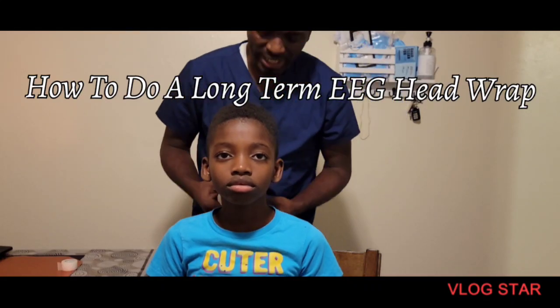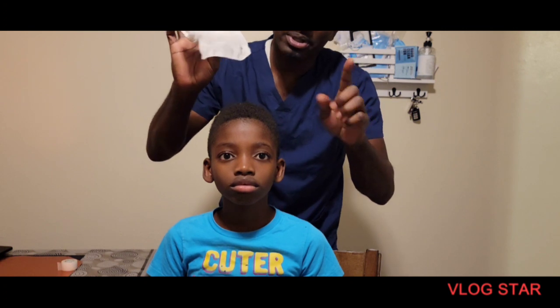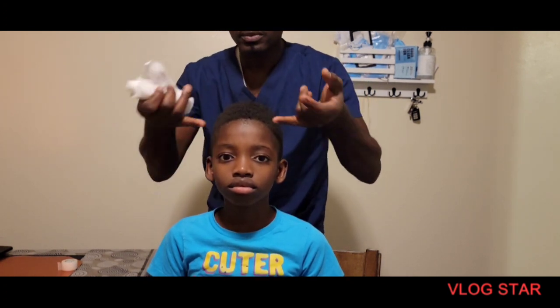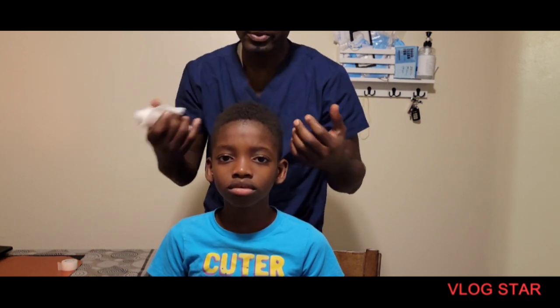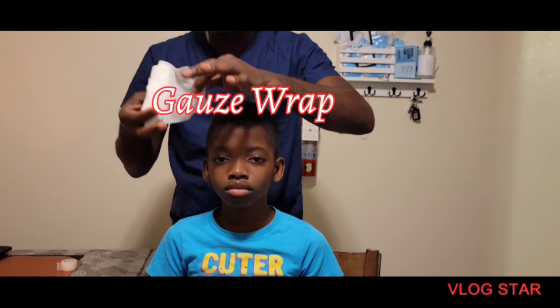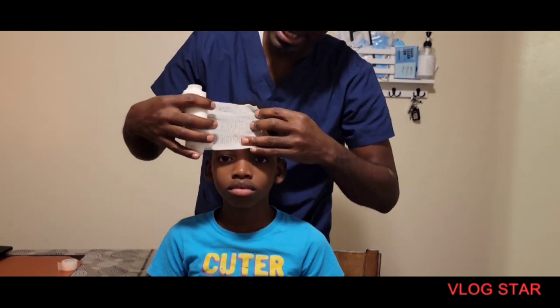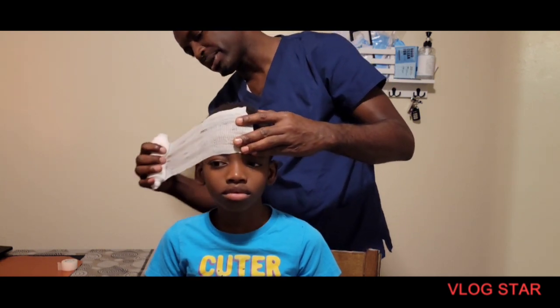Hello, my students, welcome. Today I'll be teaching you how to do the wrap for the EEG. The electrodes will be running from anterior to posterior, so these are the gauze that we're going to be using. We're going to start with the anterior and then move towards the posterior with the wrapping.